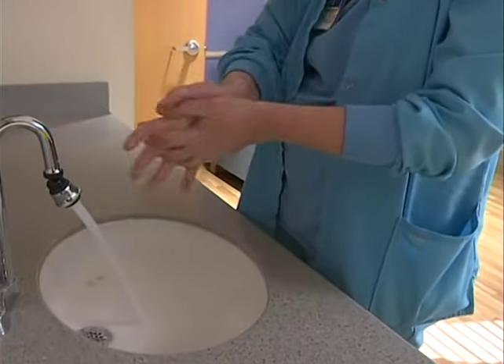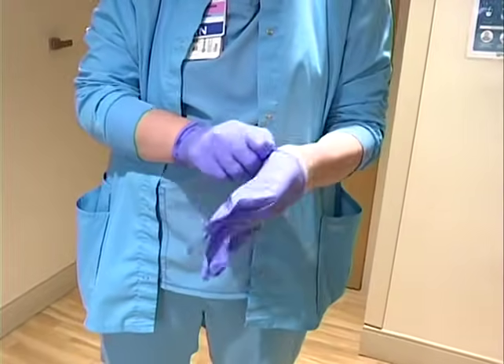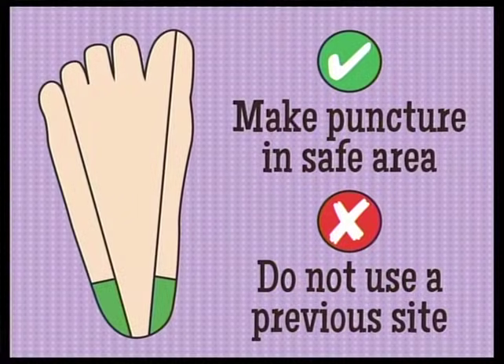Wash your hands and put on powder-free gloves. Verify the correct patient. Select your puncture site — these are the safe areas for getting the blood specimen. Do not use a previous puncture site. Use the correct areas to avoid damage to the bone, nerves, or tendons.